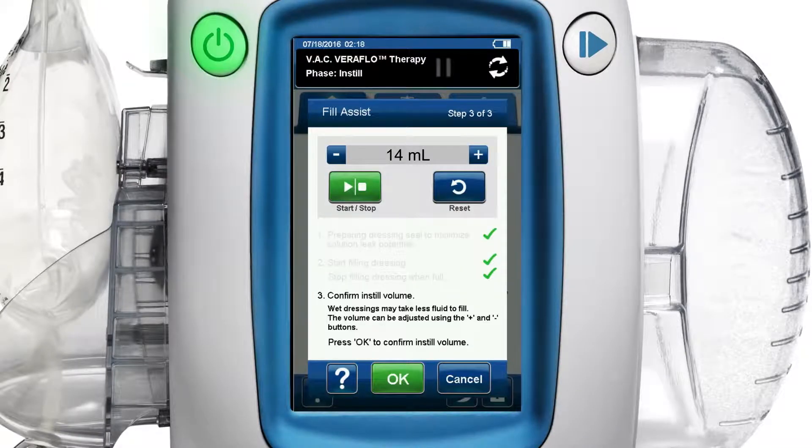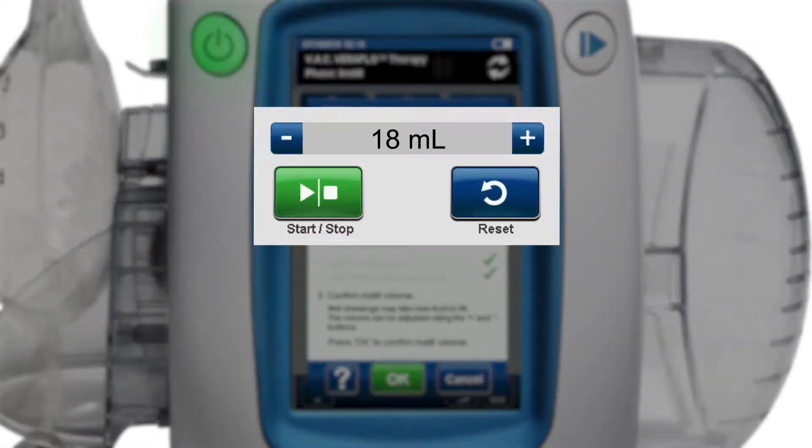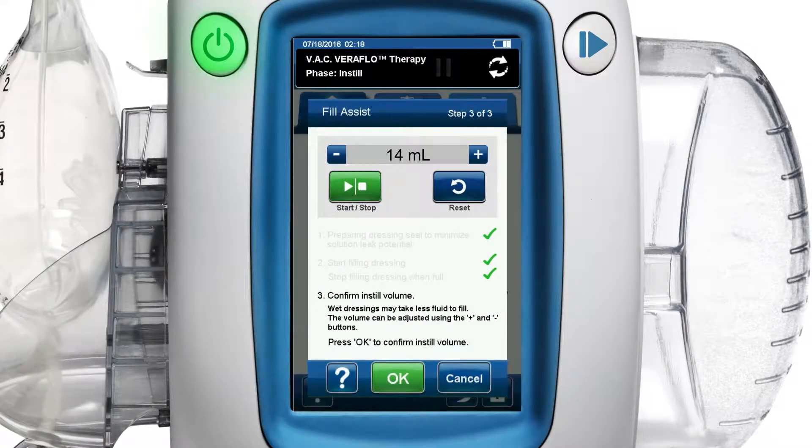Now, step 3 of 3 of the fill assist screen appears, awaiting confirmation of the volume setting. Because wet dressings may take less fluid to fill than dry dressings, consider reducing the volume 10 to 20% by using the plus and minus buttons before pressing the OK button to confirm your fill volume and move to the next screen.